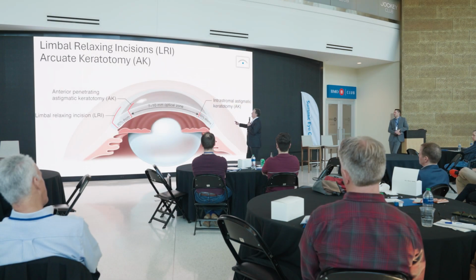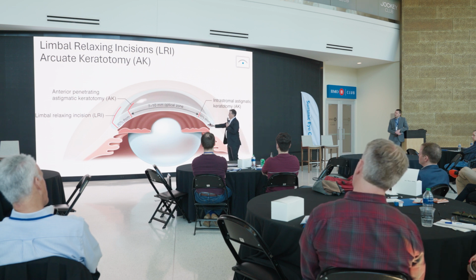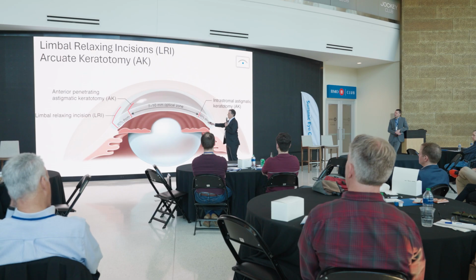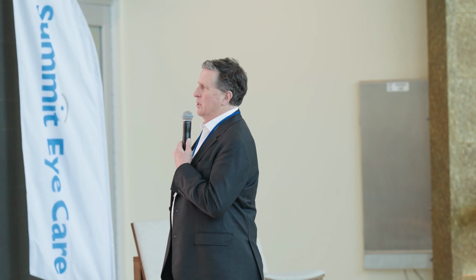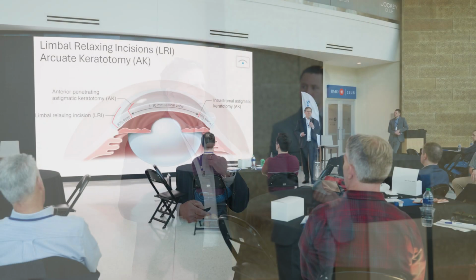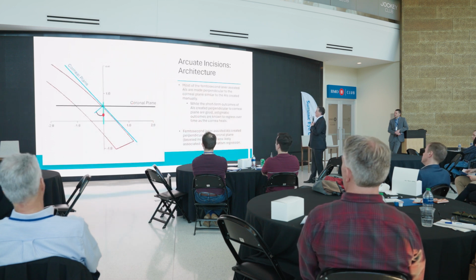The very same registration that looks where the eye cyclorotates. Now the cornea itself is imaged three-dimensionally. We get up to 90% depth, and we can then provide incisions of a precise length, and that allows astigmatic control up to about 1.25 diopters, and that's where we draw the line. And so that has really changed how we think about it.